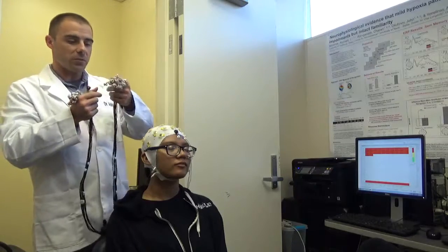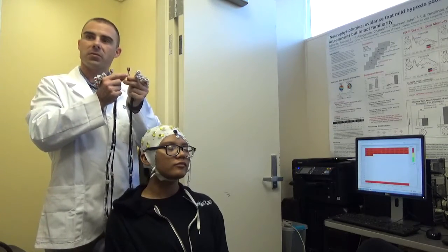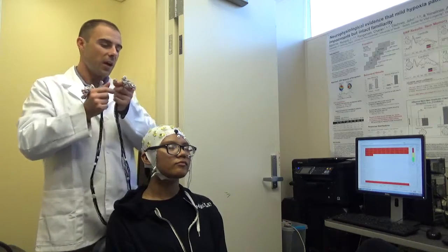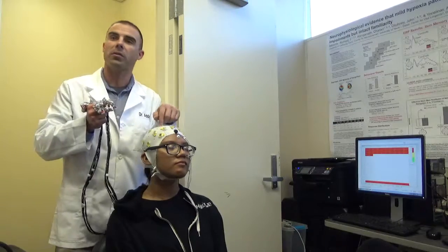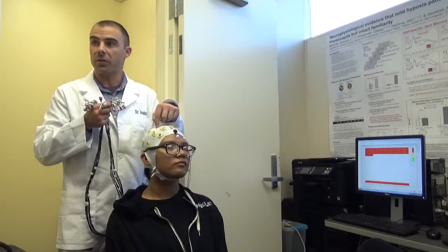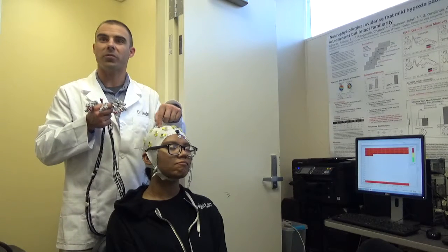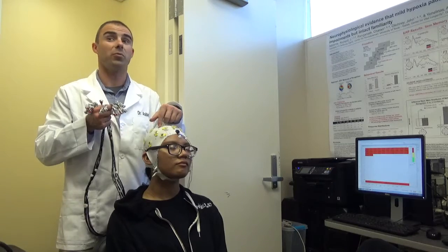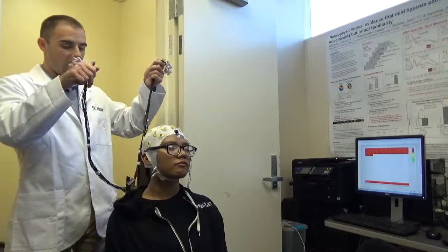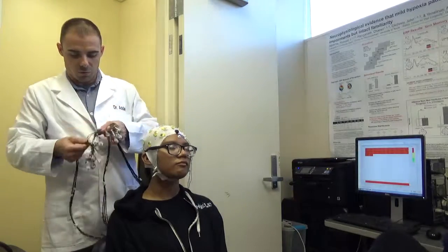one last thing to note is that every one of these electrodes has a little tag on it. And those tags are numbers. So this one says 22, 25, 26, 16, 18. And those numbers tell you where to plug it in. So you're going to match up number 30 with number 30 here. So basically don't mess up. It's not hard to do wrong, but it's also not hard to do right. And they're lateralized and they come in these different little bundles.